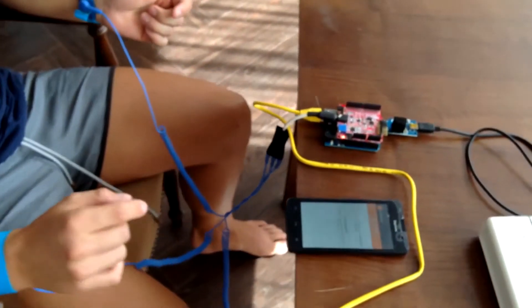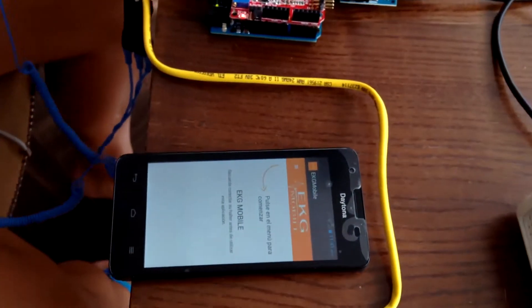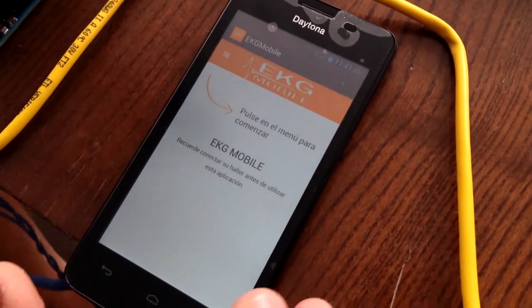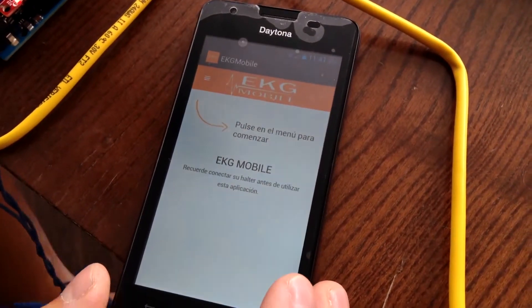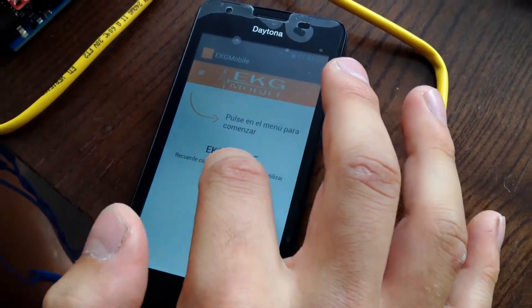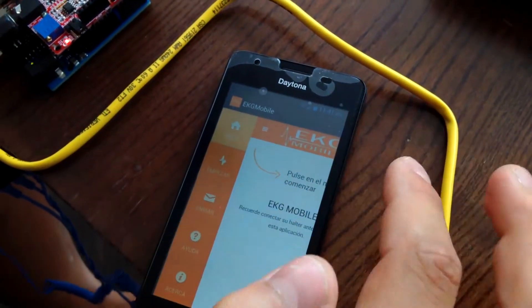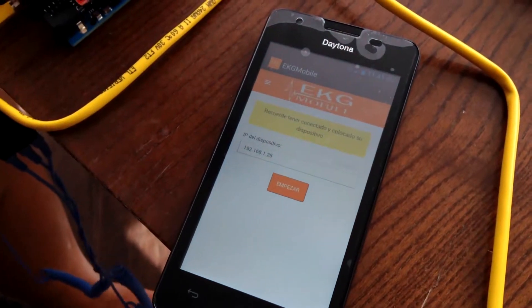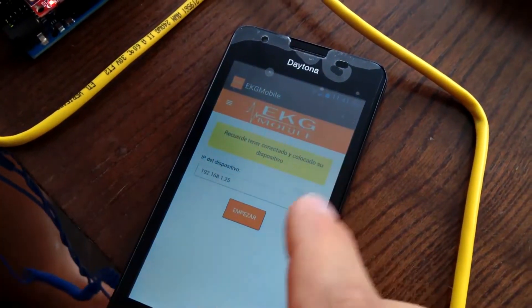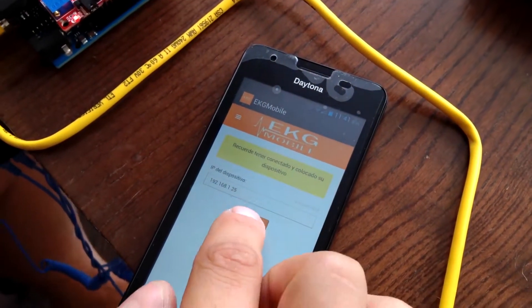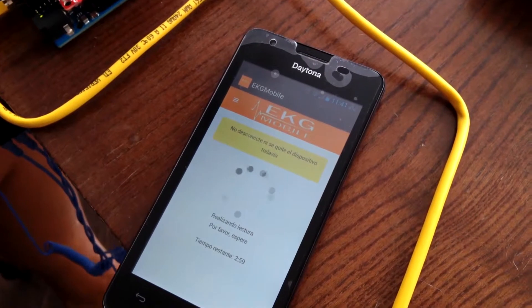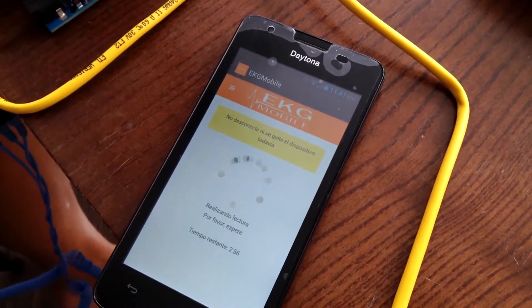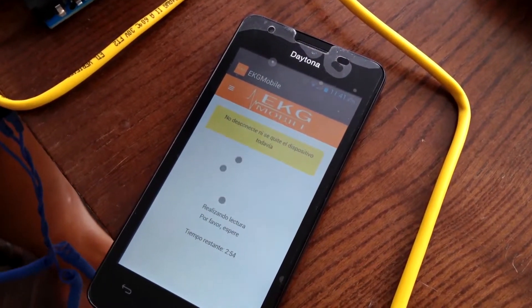The software system developed in Android is shown here. We have an initial menu where we can find the system options. To start reading, go into the Start menu and press Start. Enter the IP address of the device and click on Start. The device takes three minutes to complete the reading of the electrocardiogram.